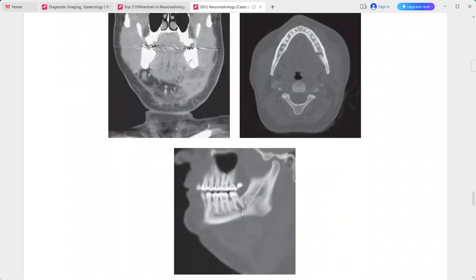There is a lucency surrounding the roots of the second left mandibular molar with breakthrough of the medial cortex. On the coronal image, the mylohyoid separates the sublingual and submandibular spaces, and the site of cortical breakthrough lies below the insertion of this muscle on the mandible.